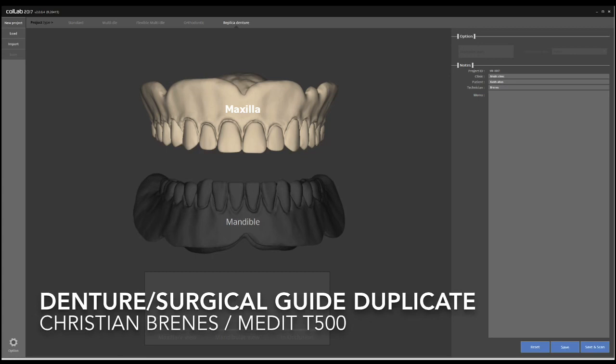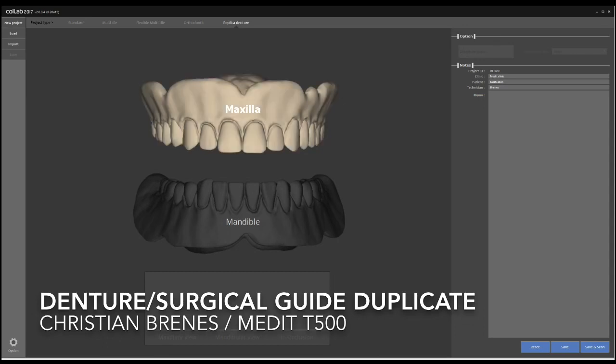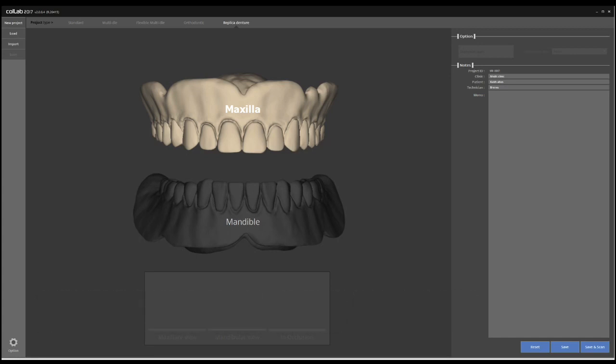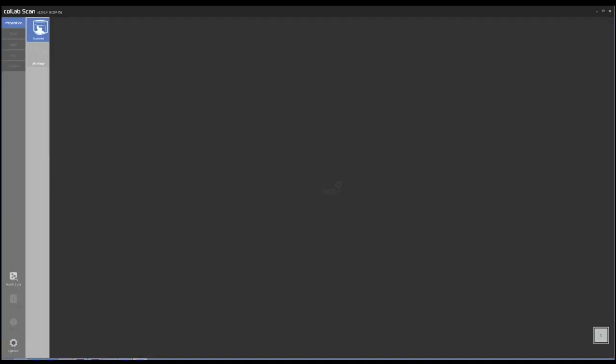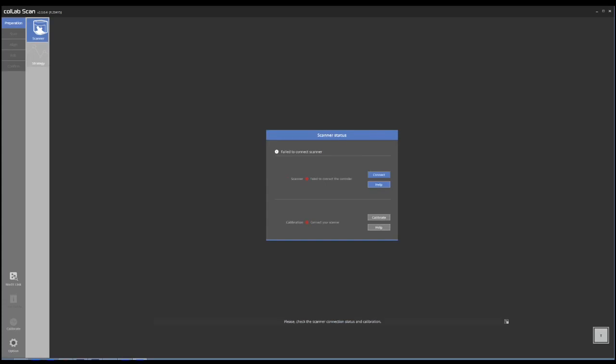The reality is, people that are doing a lot of dentures and surgical guide cases for denture patients will benefit way more from having a scanner like this because the process is way more simple and efficient. So you basically start from getting the denture in the scanner.